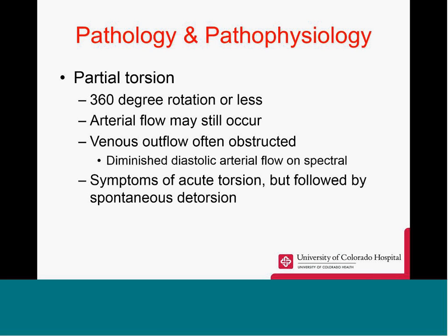With partial torsion, the patient will have symptoms of acute torsion, but followed by spontaneous detorsion and regression of symptoms. If spontaneous detorsion occurs within the affected testis, it may appear normal, or it could also mimic orchitis.